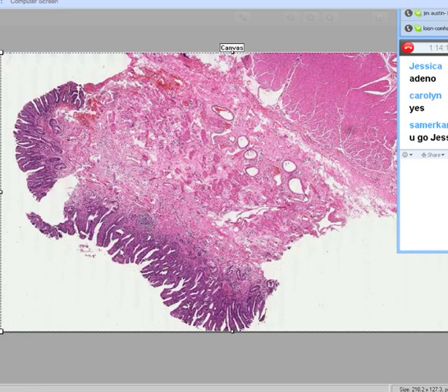Thank you. We don't really have anything more to say about this, except if you wanted to zoom in to see the nuclei of the columnar cells, you could. But you already know that these are columnar cells because you have enough experience for that. And so let's move on to the next case, 4437.